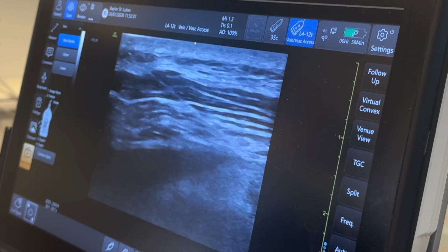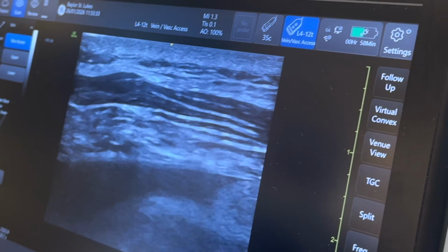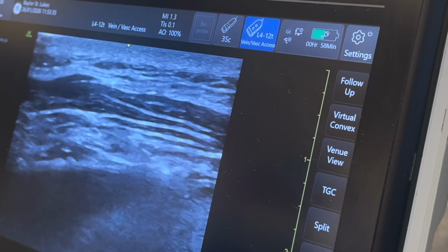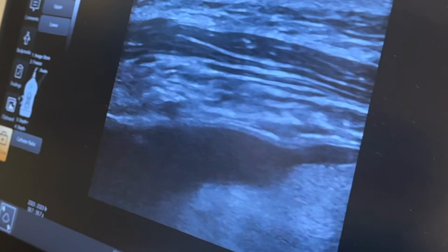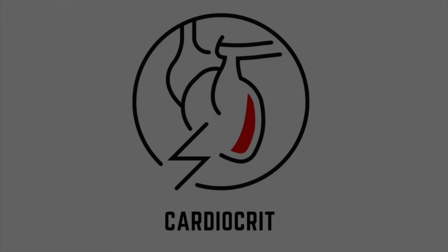If you have good control of ultrasound, good control of your needle, you can dynamically watch it go through, accessing it from a point where you have a larger anechoic rim, a larger target with that pericardial fluid, which is better. In the peristernal approach, if you have a good rim of fluid, you can use dynamic ultrasound guidance to access that fluid. And it becomes as simple as a thoracentesis, as simple as a paracentesis, and it becomes a safe, life-saving procedure.